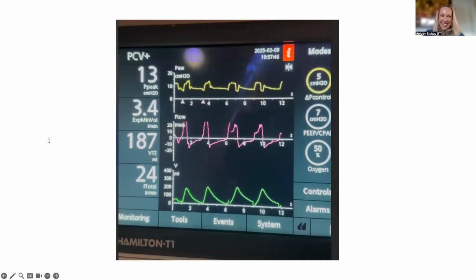Yes. What are the squiggly lines with the floating vent guy, Nick? So, this is the much beloved T1. I'm not going to say maligned.